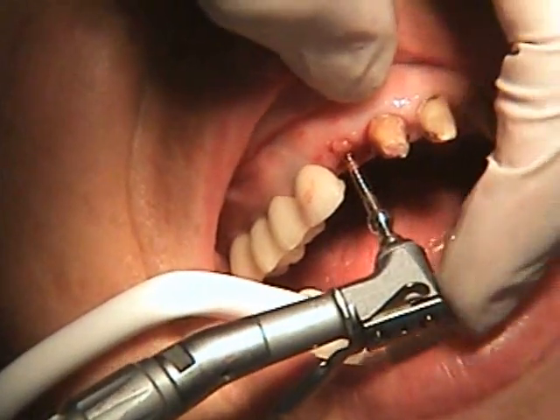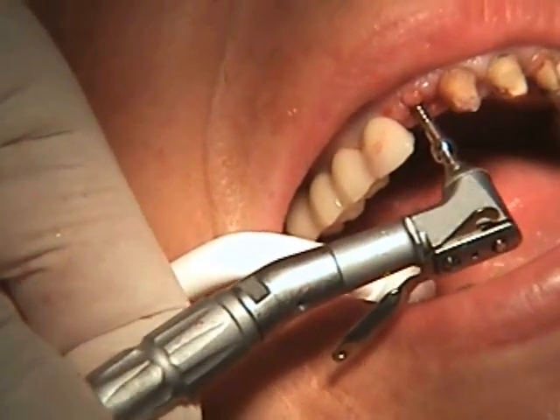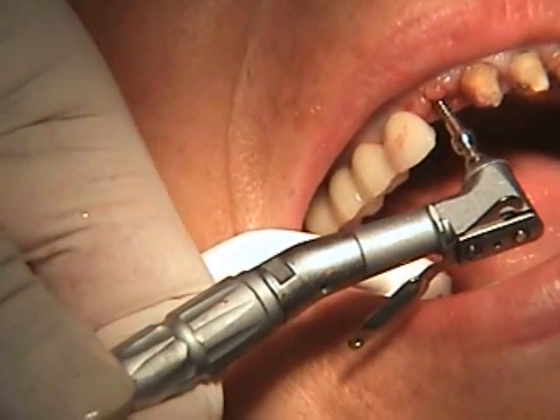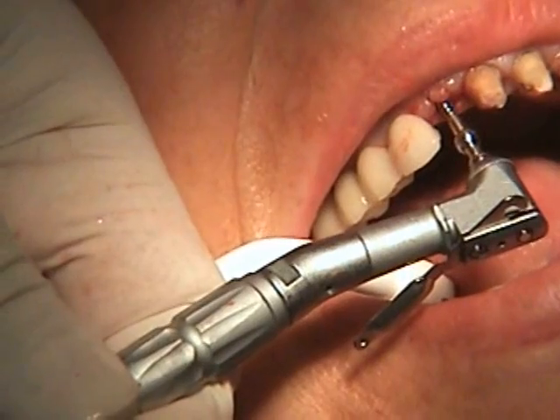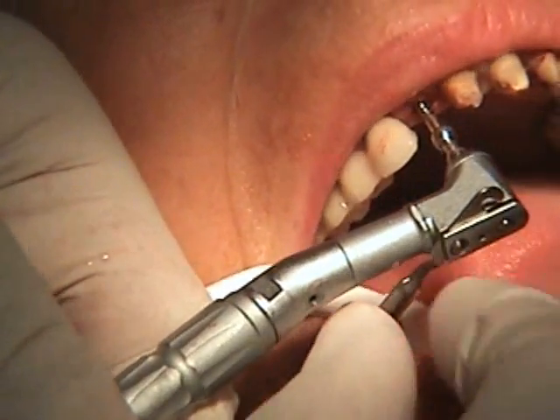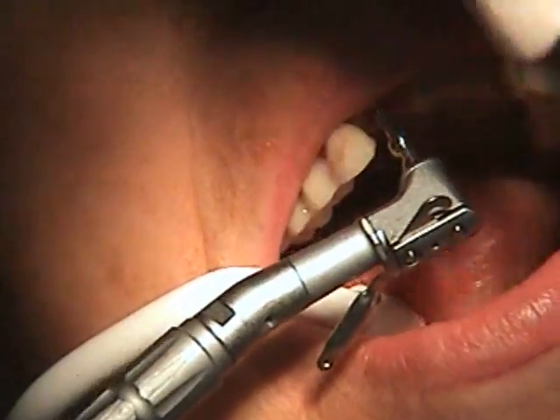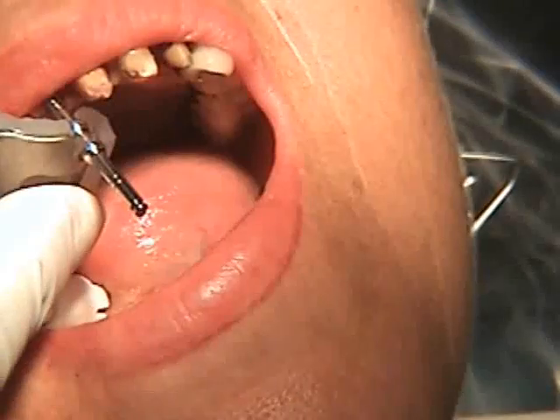We're going to use the special tool, which puts in about 50 newton centimeters maximum, and screw down the extraction screw into the root canal that we opened up. It goes down all the way. After it's nice and firm, we're going to remove the driver. You can see the two spheres — it's nice and firm.